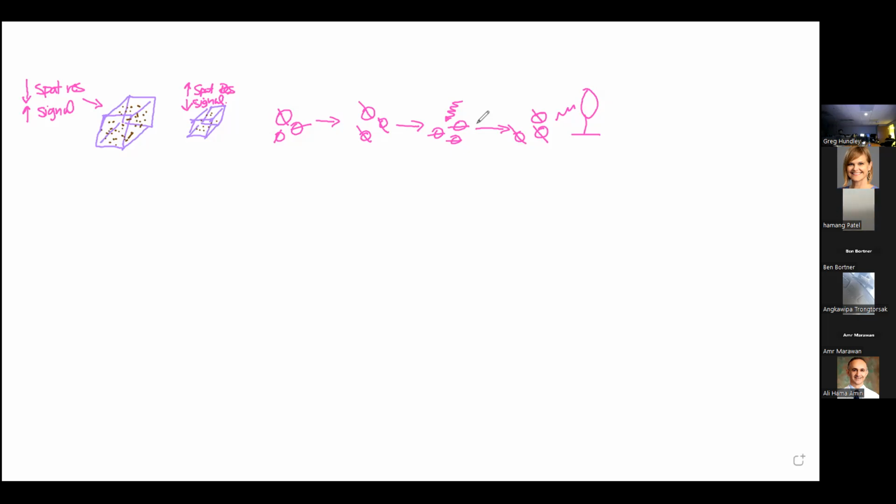You are all here for a course about cardiac MR, so what's moving? Your heart. And what else? Breathing. So how in the world do we deal with that? That's what we're going to talk about today. There are three pieces to this whole thing: spatial resolution, signal, and now something else called temporal resolution.